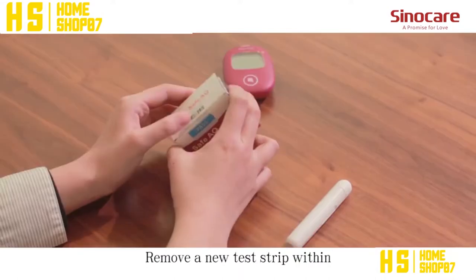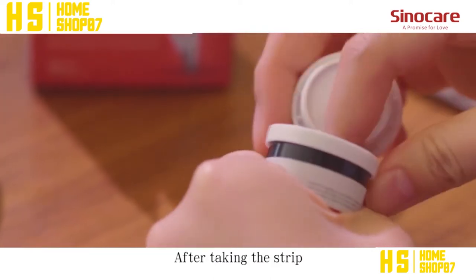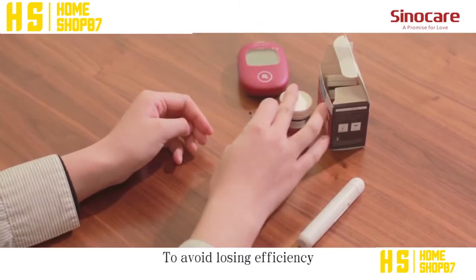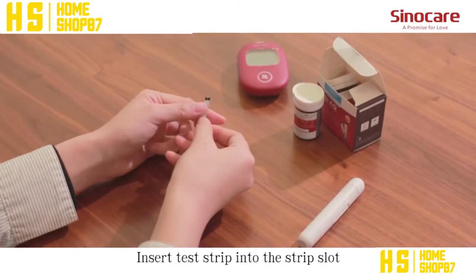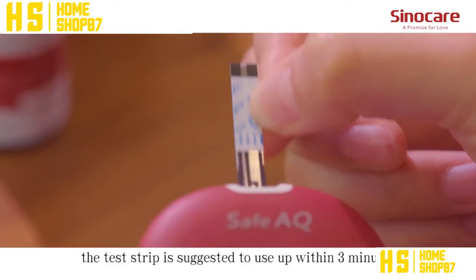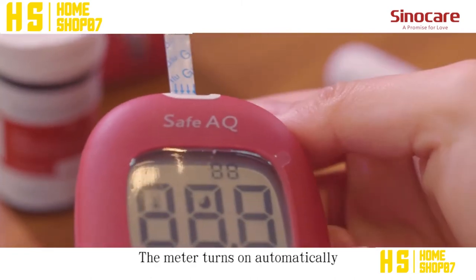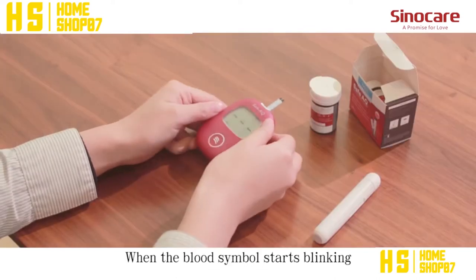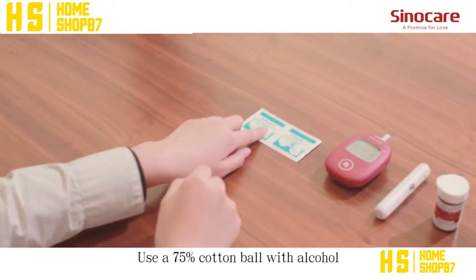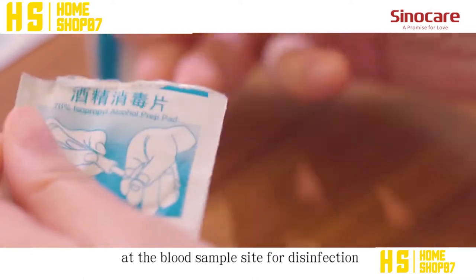Remove a new test strip within the valid expiration date from the vial. After taking the strip, immediately cover the vial to avoid losing efficiency. Insert the test strip into the strip slot. The test strip is suggested to be used within 3 minutes. The meter turns on automatically. When the blood symbol starts blinking, the meter is ready to use.